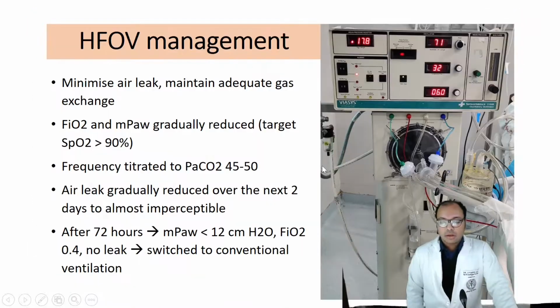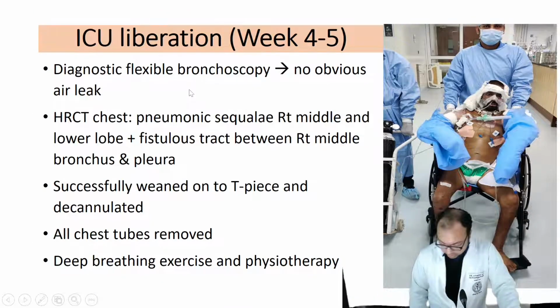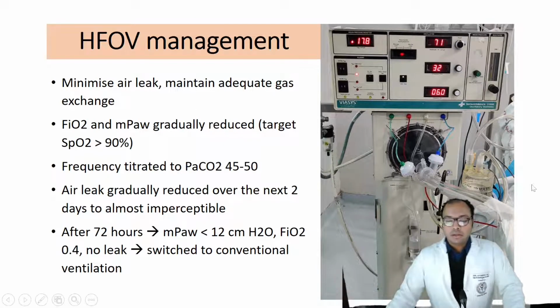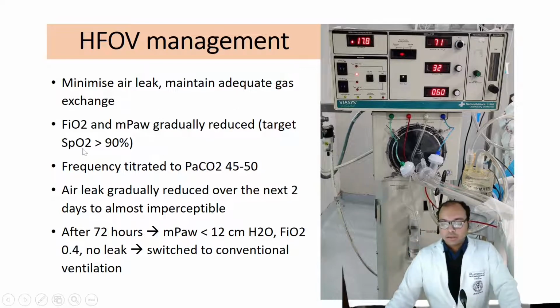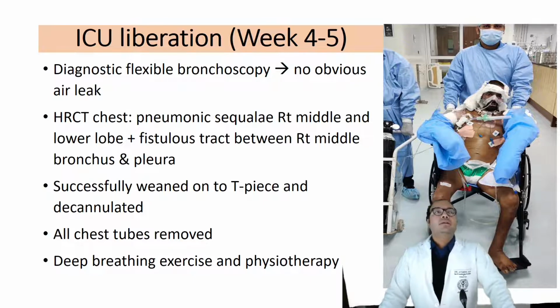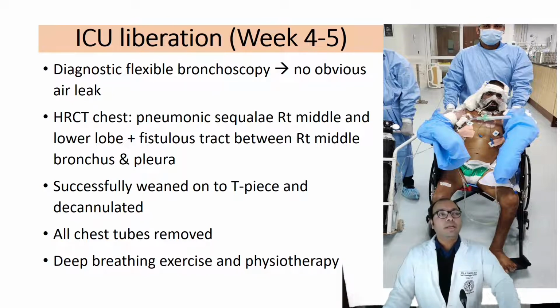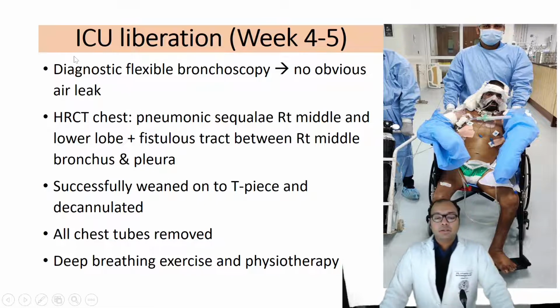After this, we again reinstituted conventional ventilation, and the flexometallic tube was still in situ. We connected to a normal ventilator by this time, and the patient started showing gradual signs of improvement, so we could switch over to weaning modes in the form of pressure support ventilation, and subsequently the patient gradually improved.